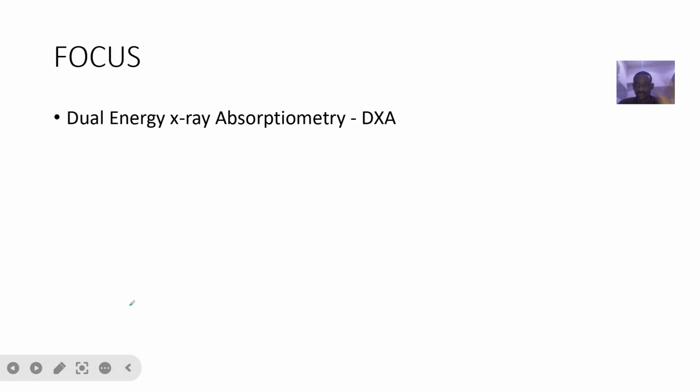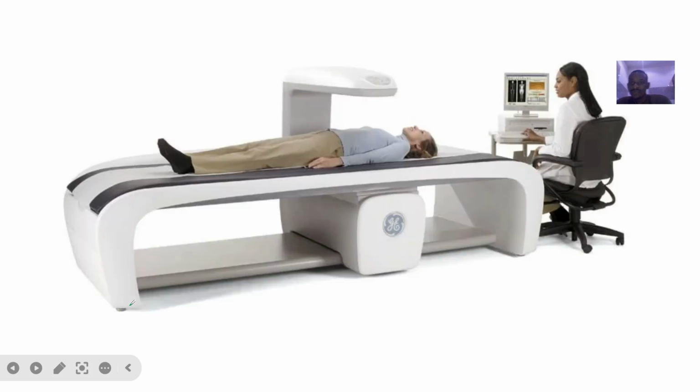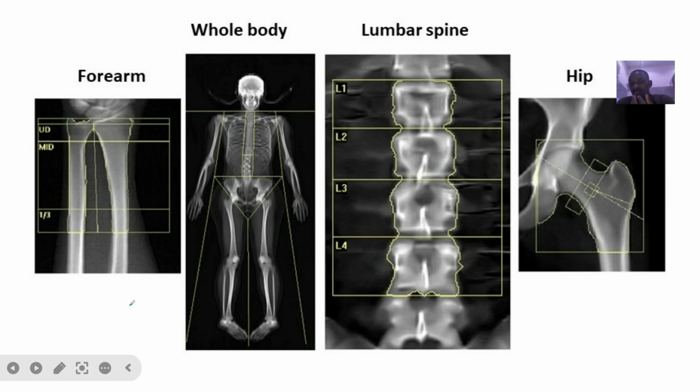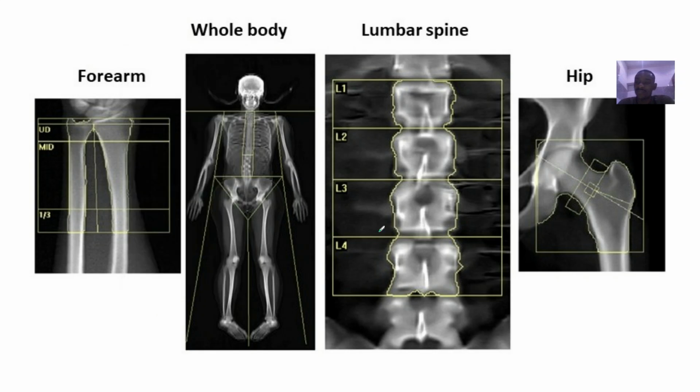Right. So for the next, it's more of an imaging modality. This one is mainly to diagnose and check the density of bone. I want to check my calcium levels. I want to see maybe why a patient actually had a fracture, everything related to bone. I just want to see how strong somebody's bone is.